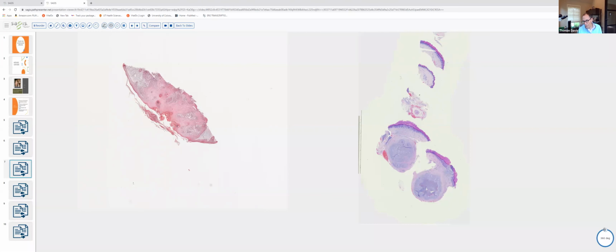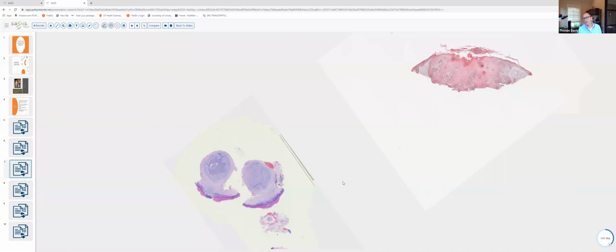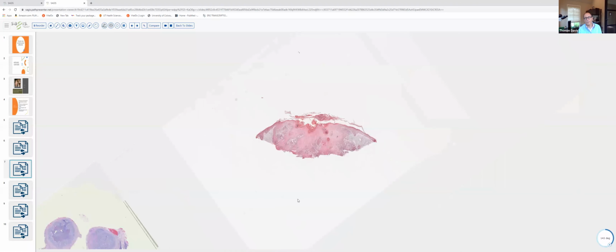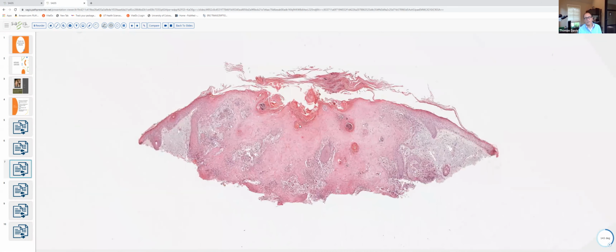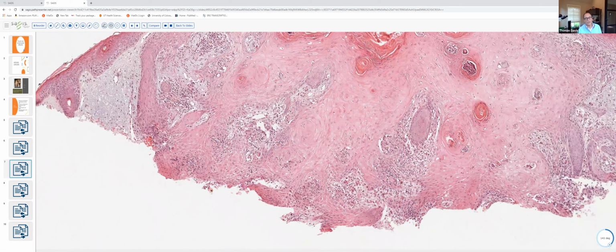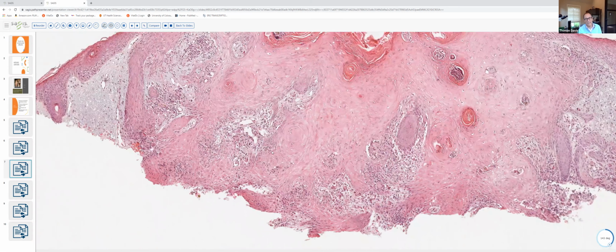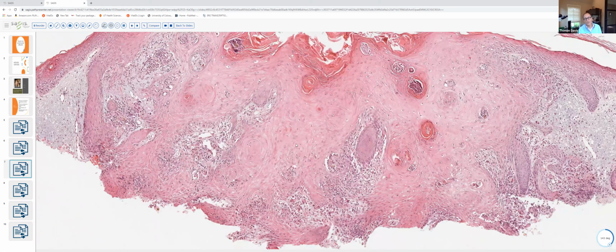I'm going to go ahead and start with chromo, and I'm going to flip it. I think people are used to looking at slides that way with the epidermis on top. And what we have here is a very characteristic appearance for chromomycosis. We've got marked pseudoepitheliomatous hyperplasia. You can see these tongues of very highly squamatized epithelium or epidermis extending out into the dermis. There's interconnection of these. There's not too much cytologic atypia. And in particular, we have pseudoepitheliomatous hyperplasia with pus.